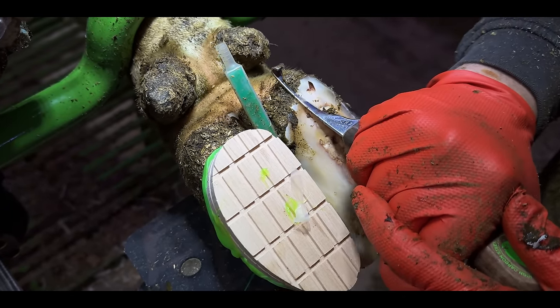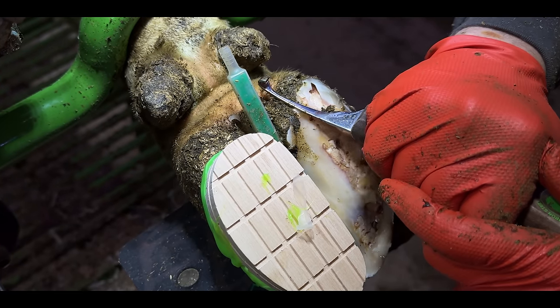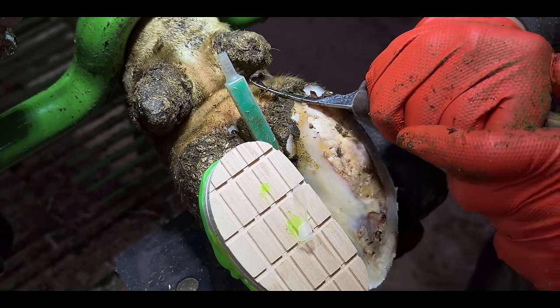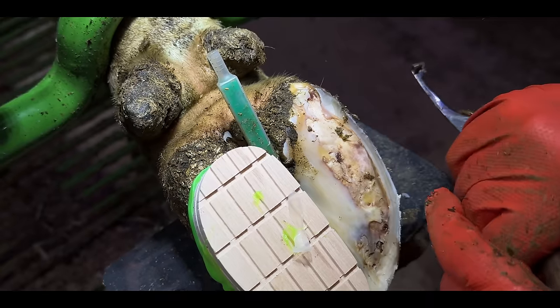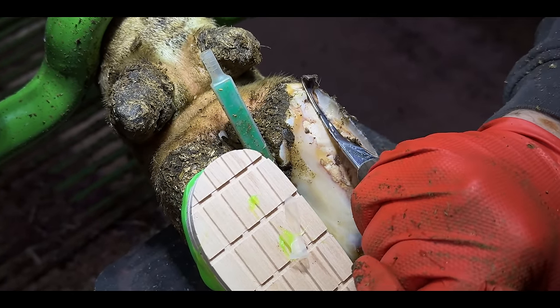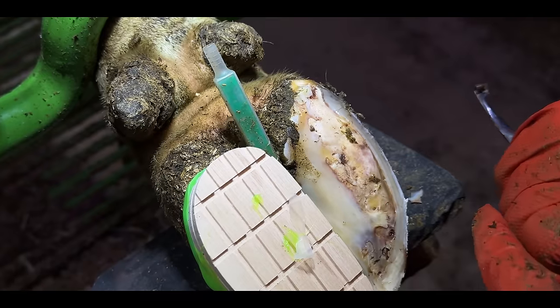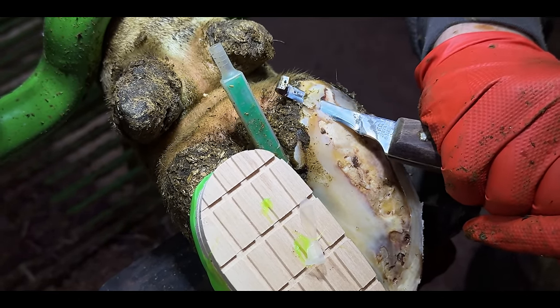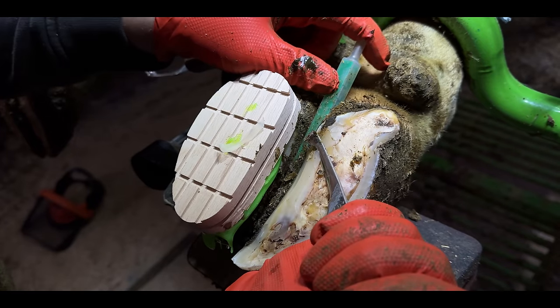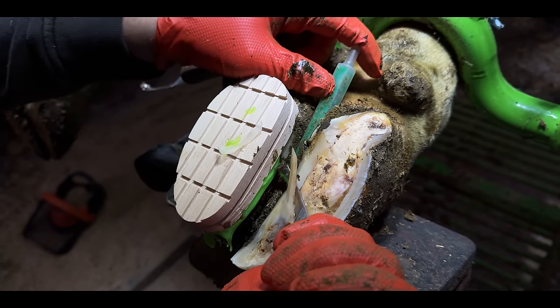I didn't expect this part of her hoof to be opening up so much, and now I'm worried that it tracks all the way up throughout her heel. But luckily for us and for the cow, this small swipe of the knife alleviates my fears. I've been avoiding trimming away that loose hoof horn towards the inner portion of her hoof, but time is running out and I can't avoid it any longer.